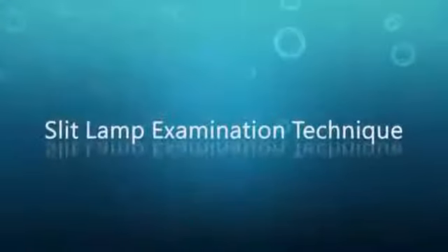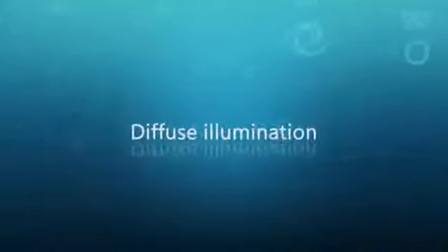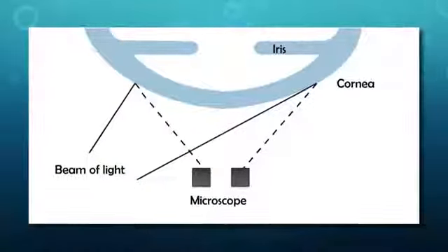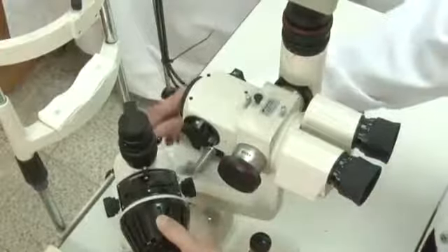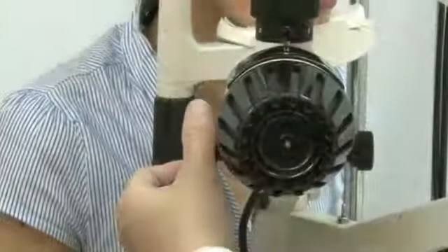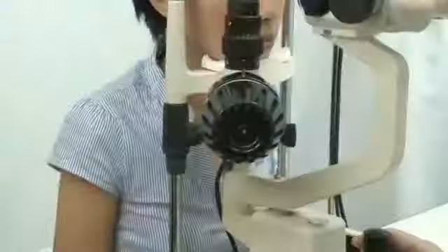Slit lamp examination techniques can be divided into three categories according to the type of illumination. The first type is diffuse illumination, formed by using a wide slit beam. First, set the light source and microscope separated by 45 to 60 degrees. Then set the light source as a wide slit beam and to the lowest intensity. Begin with low magnification. If any unusual condition is observed, gradually increase the magnification for more detailed examination.